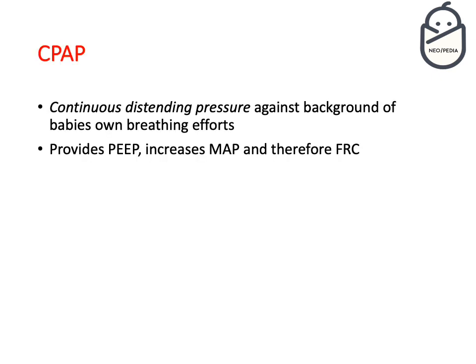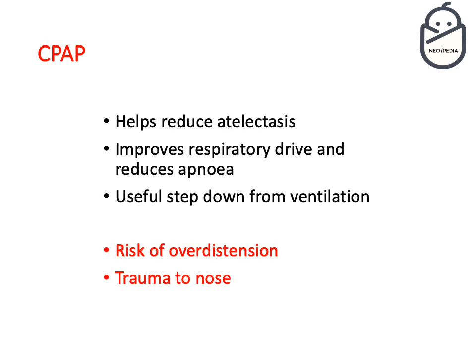All right, going back to the CPAP. CPAP basically will help to reduce lung atelectasis because it will inflate the lung well. It's also going to improve your respiratory drive and reduce apnea. That's why we use it in apnea more than we use high flow, although there is no major evidence to support that, but this is our usual practice. And it's a useful step down from ventilation, and again, this depends on the unit where you are practicing these ventilation modes.